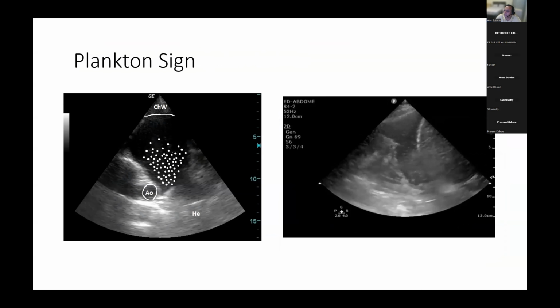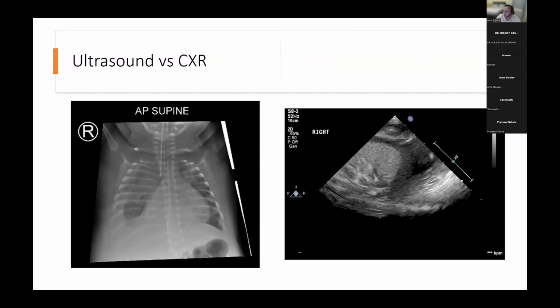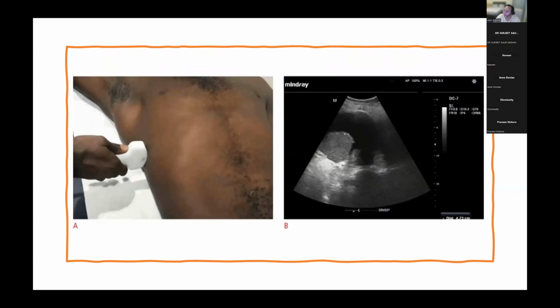It's not that bright as we saw in the picture which we are analyzing now. So what would be as bright? What would give you that kind of brightness? It's virtually bone bright. What is a really good reflector? Air. Bone. Very good. Air.